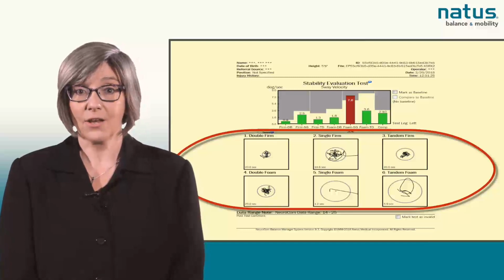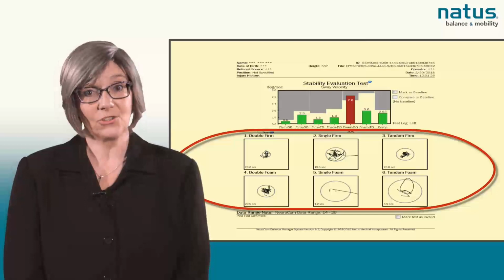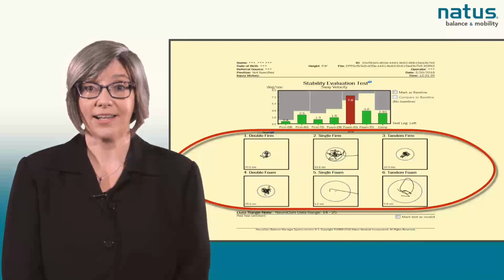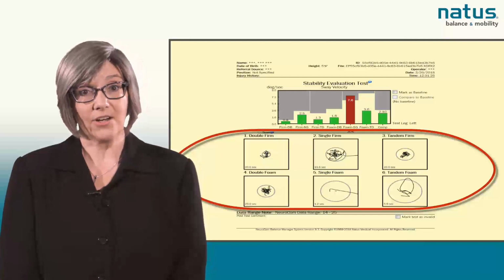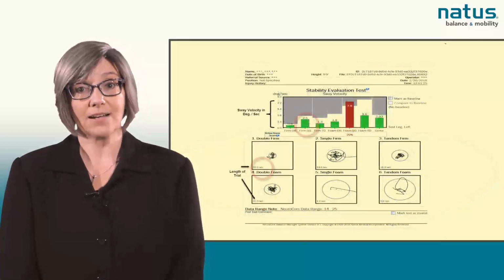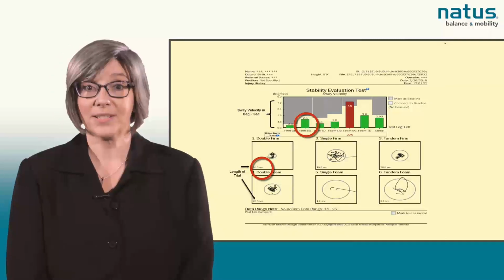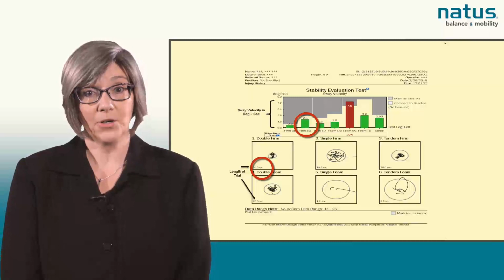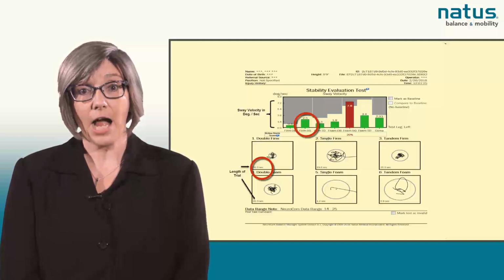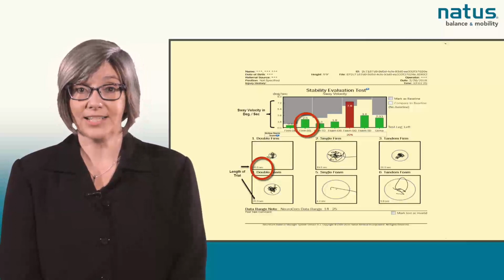The 6 boxes represent the center of gravity, or COG traces, for each condition. The circle in the center represents the normal sway excursion expected for each trial. The gray shaded area on each graph represents the normative data range. Green boxes indicate performance within the normal range. Red boxes indicate performance outside the normal range. A numerical value is given at the top of each bar. Clinicians have the option to mark a test as a baseline or to compare current results to a previous baseline test.